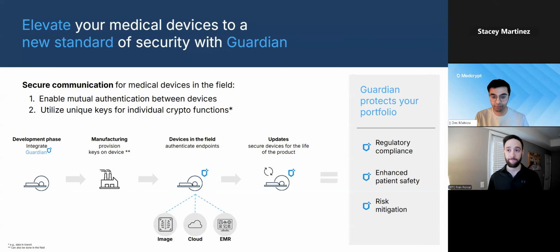And how do you do a remote update while a device is in the field? The old-fashioned way is to go carry around a USB stick, send representatives in the field and tell them to go update it. That's expensive at scale.